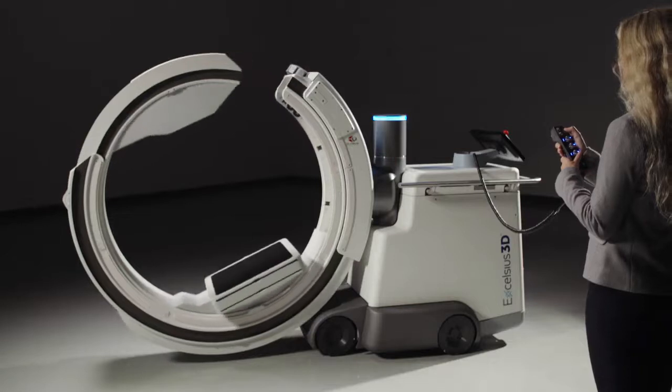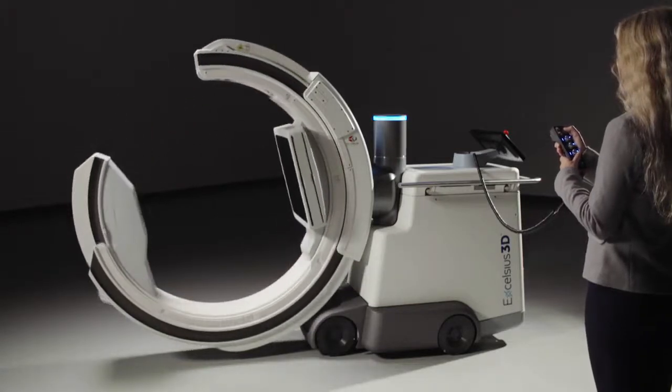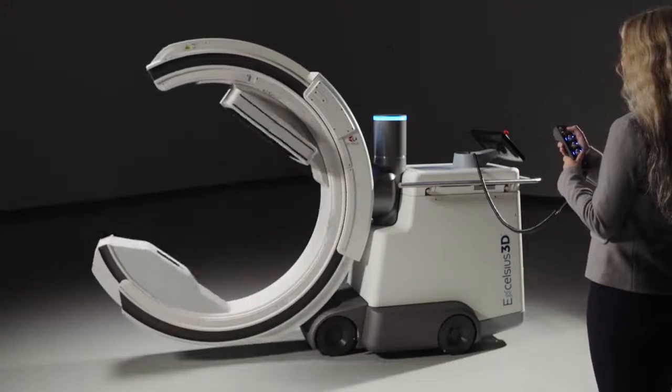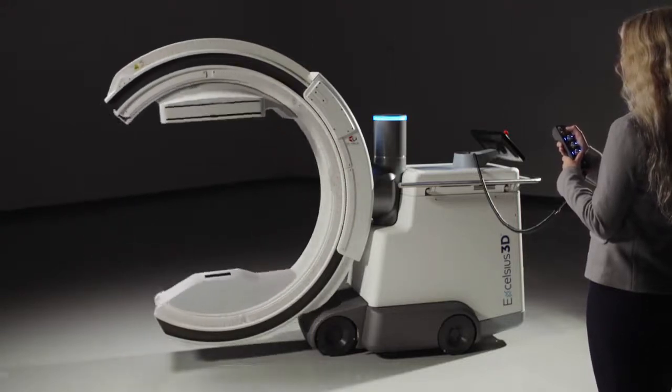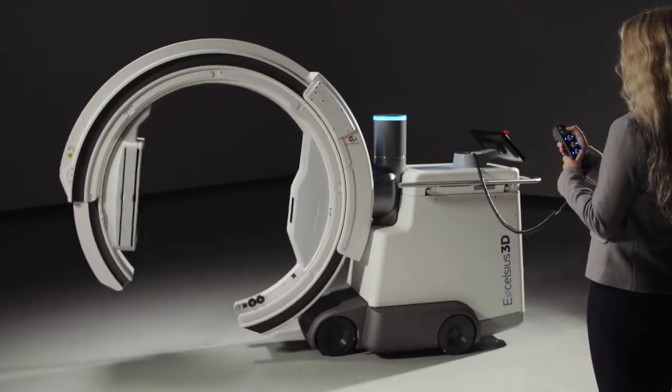Excelsius 3D's gantry is equipped with two C's, an inner and an outer, that are nested together but rotate independently to achieve 360-degree rotation. This complete 360-degree spin optimizes image quality in 3D, as compared to some single-C systems that can only achieve 180 to 200 degrees.